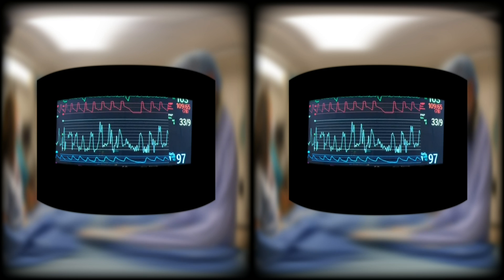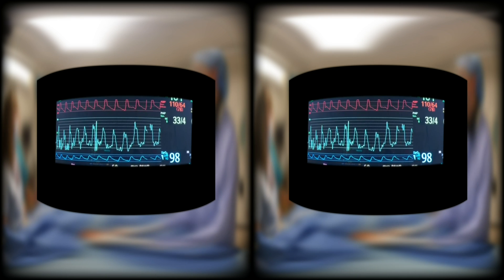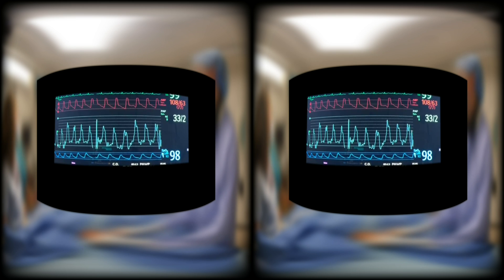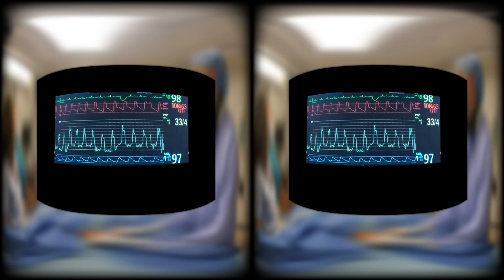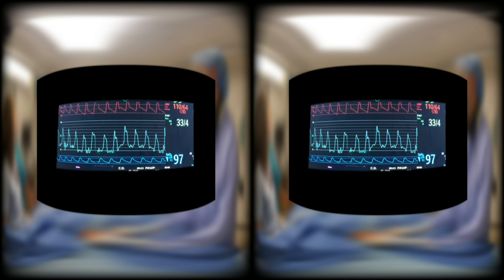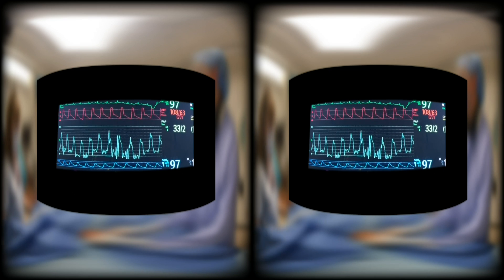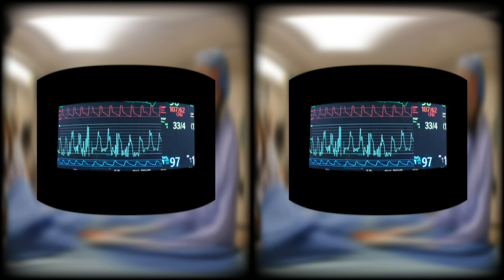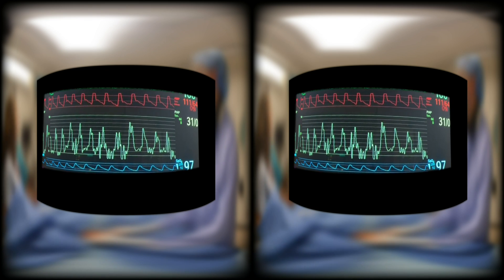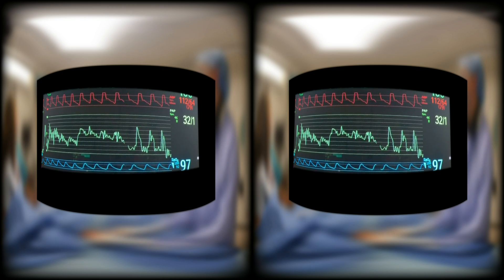As you advance the catheter, you will come to the right ventricle. The systolic pressure here is much higher, and the diastolic pressure is lower. Once in the pulmonary artery, the waveform changes again, with the systolic pressure remaining roughly the same, but the diastolic pressure rising.